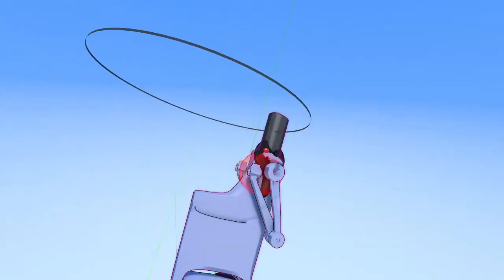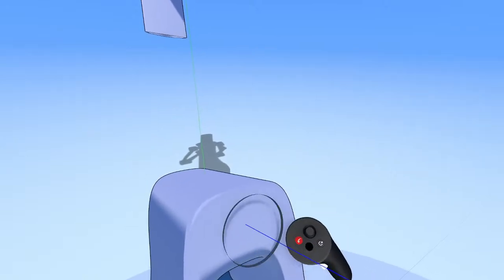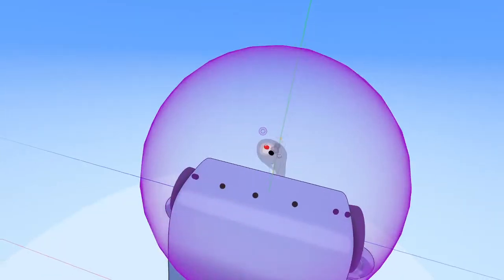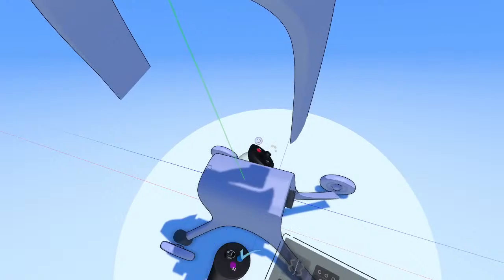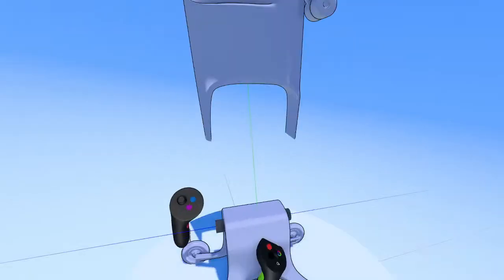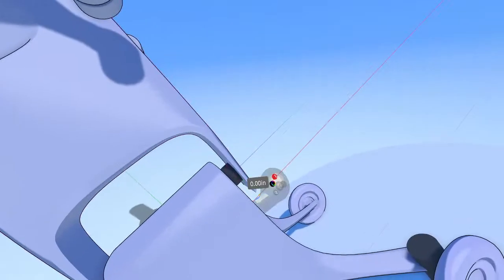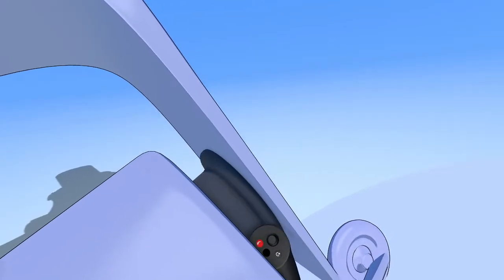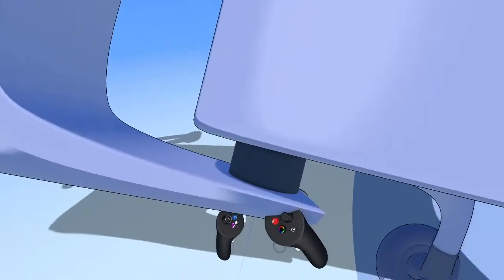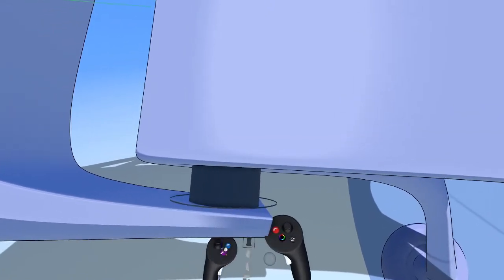And another thing that I want to add here, I'm just going to group all those shapes, is the pivot point down here. And I just want to indicate this, so I'm going to use the revolve tool here. Turn that so that all the thickness is there. Drop this guy back down like that. And then we have something that's like a pretty decent stand-in for a pivot point. Again, if you wanted to, you could add, of course, a bunch more detail there, like the housing. But we're not going to worry about that.